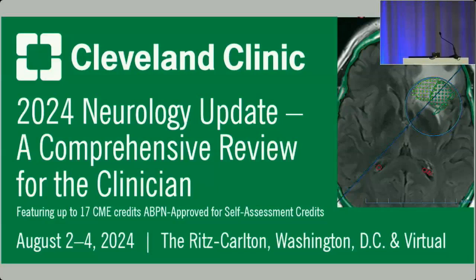Now, burst suppression by itself is easy to define. There's a period of suppression of the EEG less than 20 microvolts, or 10 microvolts, followed by a series of bursts. If these bursts are associated with myoclonus, the worry is that the status is still persisting. So each burst results in myoclonus, and it's typically seen in an anoxic ischemic event. But yeah, so a lot of it's clinical.